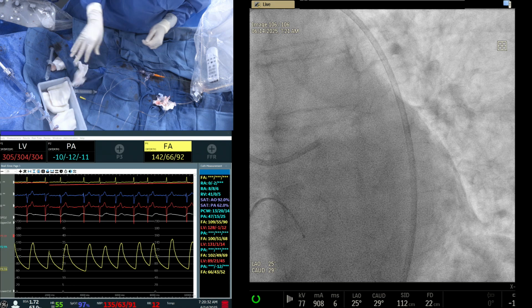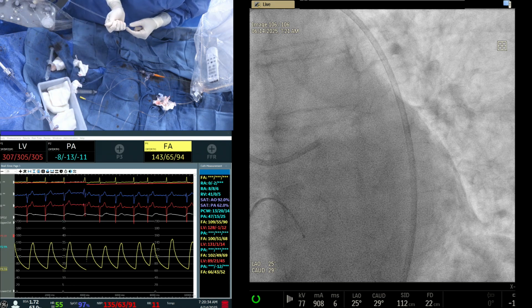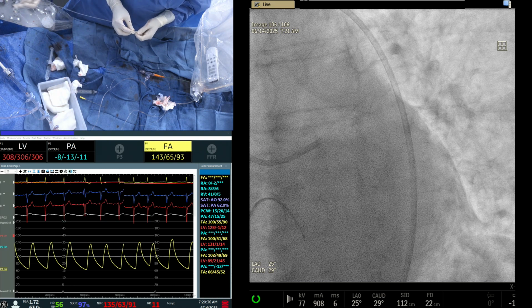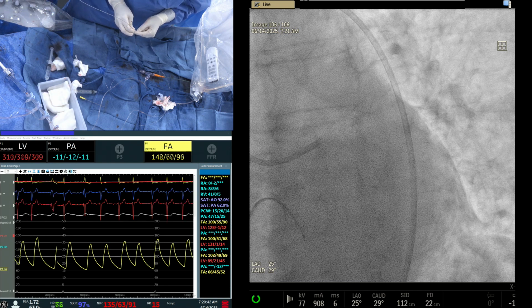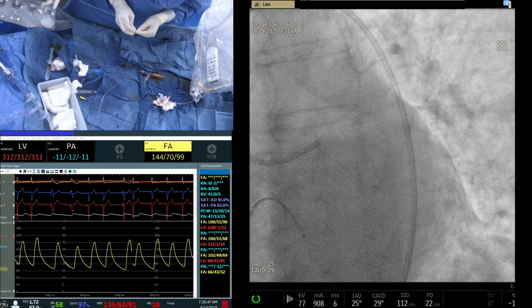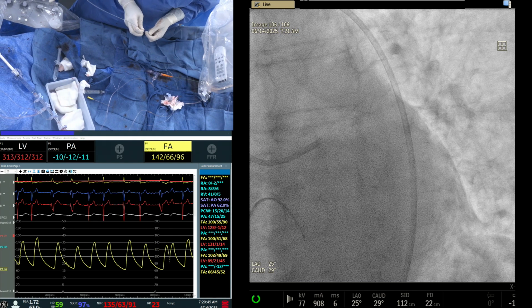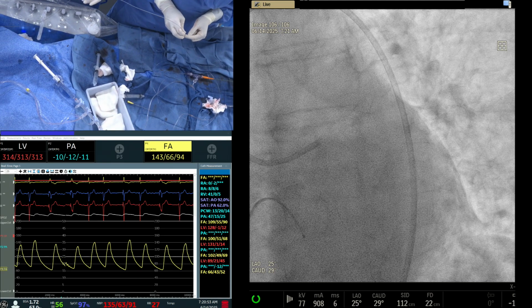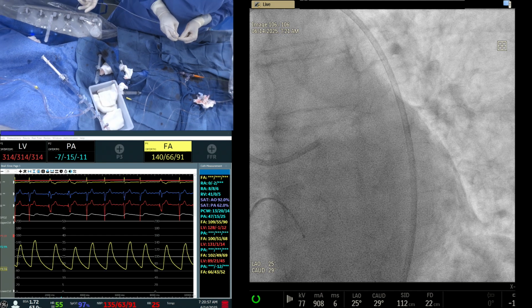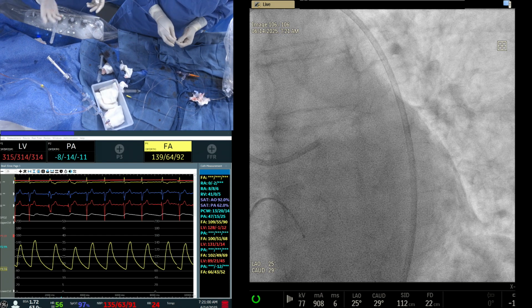And this is a case actually, if you need any time, we have the impeller in the room. Some cases we are done. This complex case, balloon valvuloplasty, then impeller assisted PCI. We have now 28 cases. I think the review of our cases of the last 3 years, 28 cases of this kind, our fellow has prepared, and a very safe strategy. The idea there is just a moderate BAV. You're not going for the finish line because we know that's not the issue here.